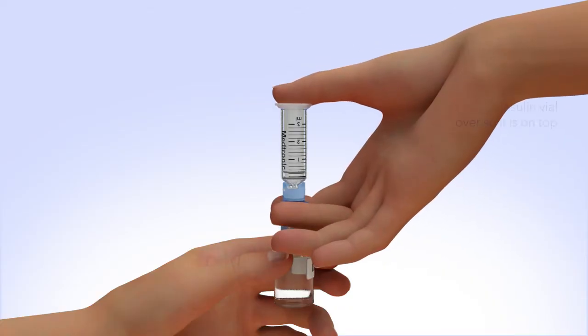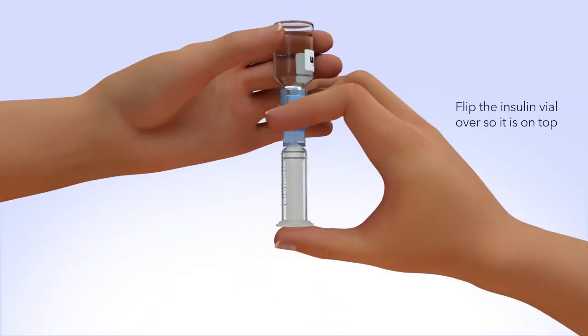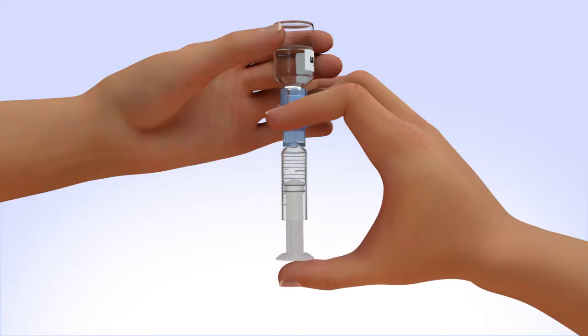Holding the plunger with your thumb, flip the insulin vial over so it is on top. Make sure you are holding the vial with your other hand. Slowly release your thumb pressure from the plunger rod, and the reservoir will start filling with insulin.